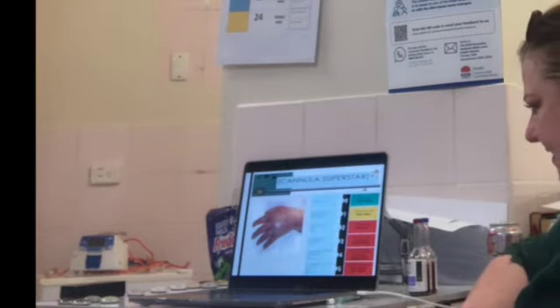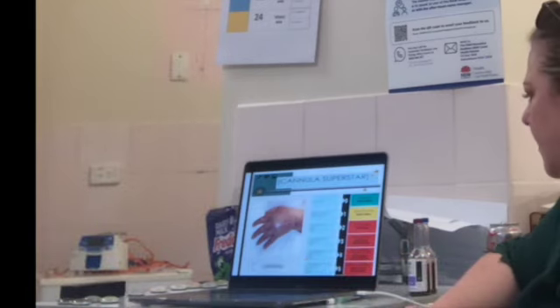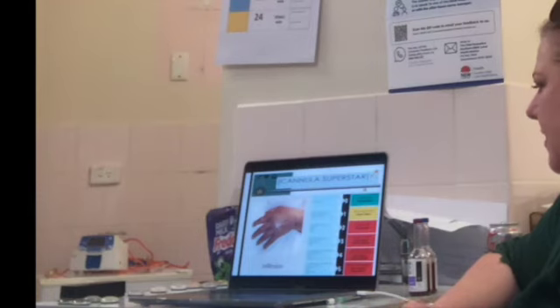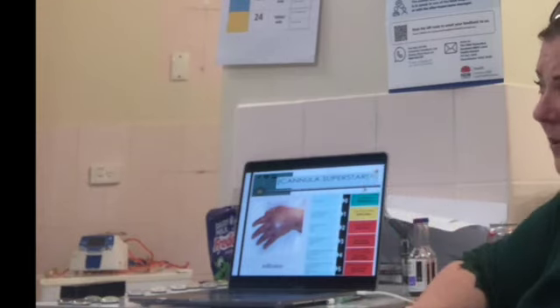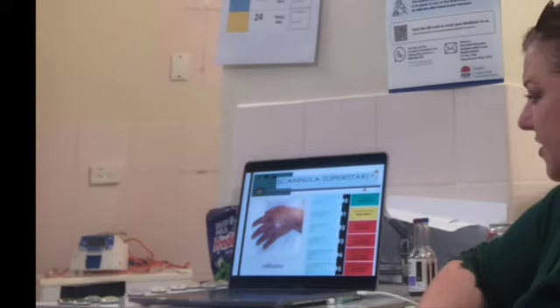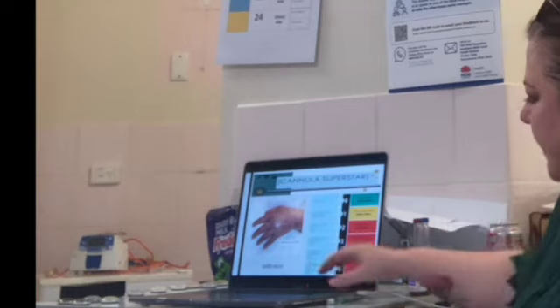Alright, have a look at this one. This is infiltration. Oh, poor person. So what do you reckon with the cannula? Warm it, compress and elevate it. It came down quite quickly, but as you said, there can be quite adverse outcomes with infiltration.